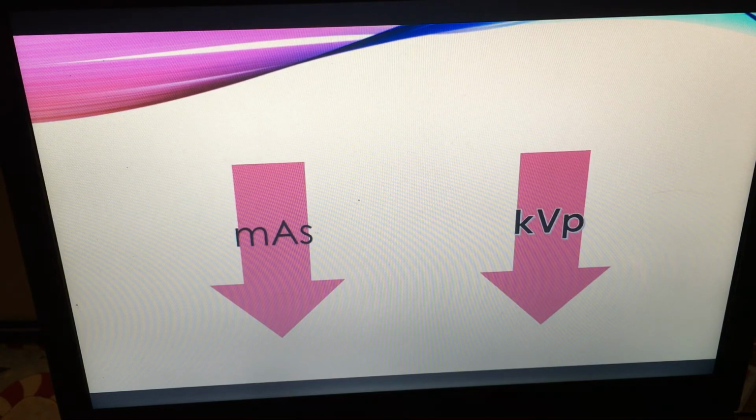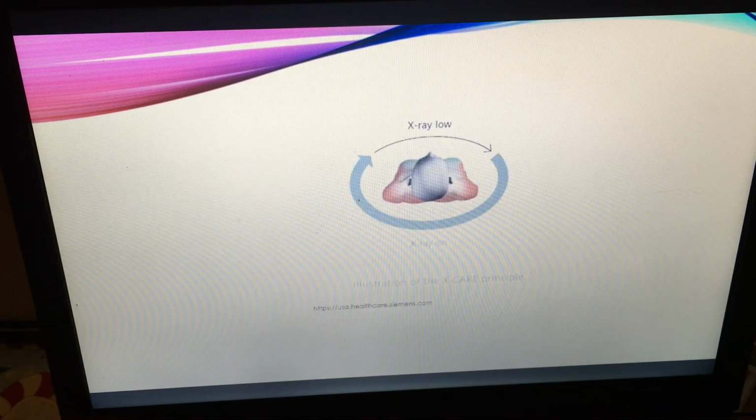According to the article, Bismuth Shielding in CT, Support for Use in Children, additional radiation reduction techniques are reducing tube current time products, using tube current modulation, reducing kVp, and limiting both scan regions and multi-phase examinations. Siemens Medical Solutions also developed X-Care. This reduces patient dose to radiosensitive areas.